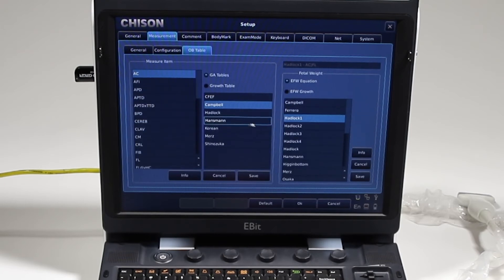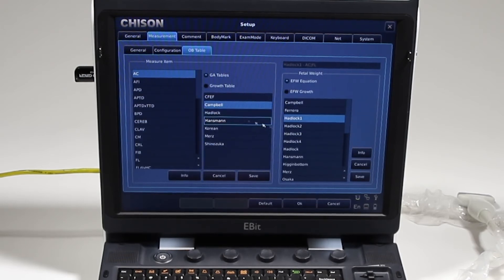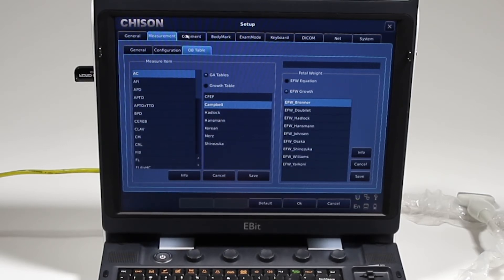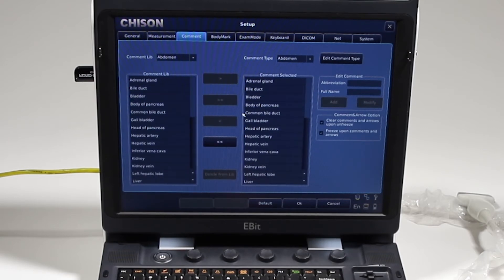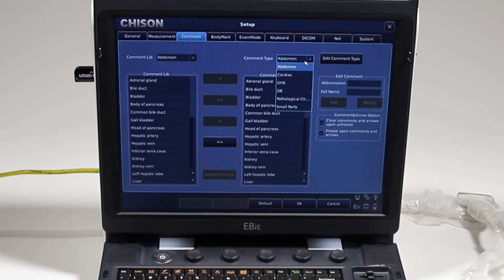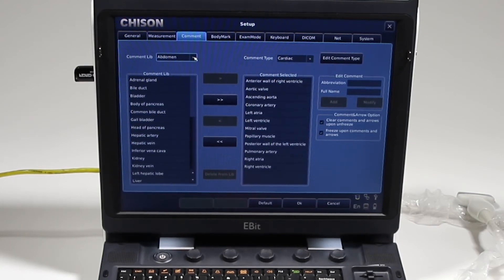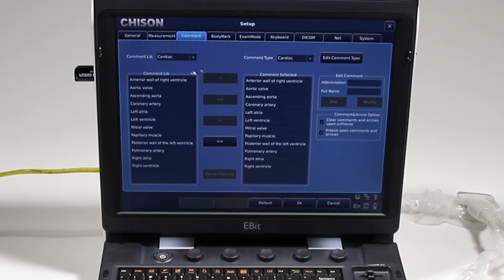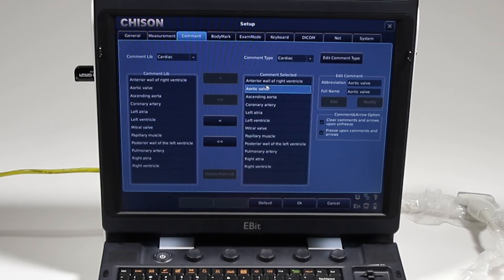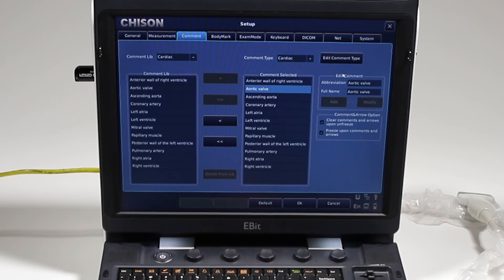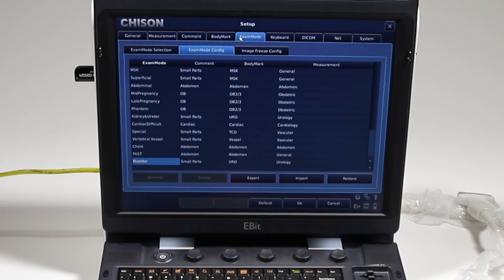OB tables: which measurements you want to use as far as the calculations and the packages and the growth charts. Comment: it's pretty straightforward. You can create your own comment library, you can edit your own comment. You're going to select the package where you want those comments to appear. First I'm going to choose, here we're going to do cardiac, and then these are the types that can be added to your menu.